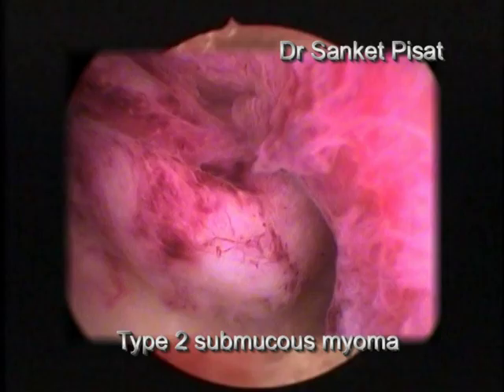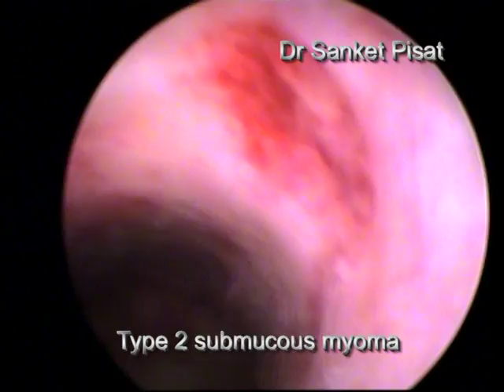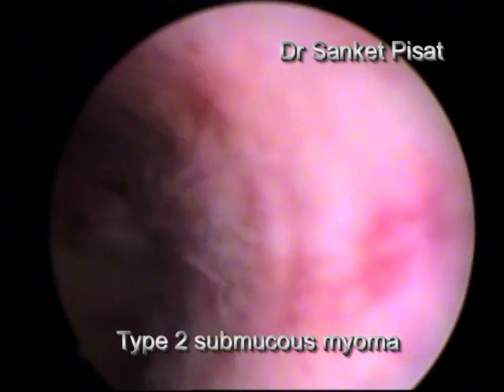This is a patient with a type 2 submucous myoma, partly projecting into the uterine cavity and partly located in the uterine wall. Cursory examination shows the rest of the cavity to be normal without any apparent pathology.